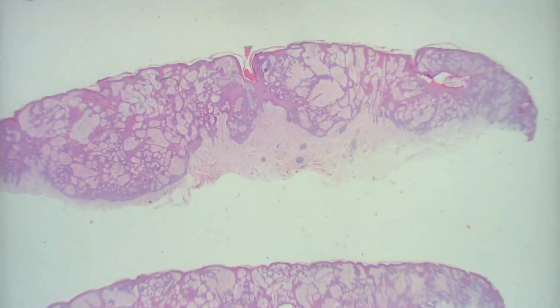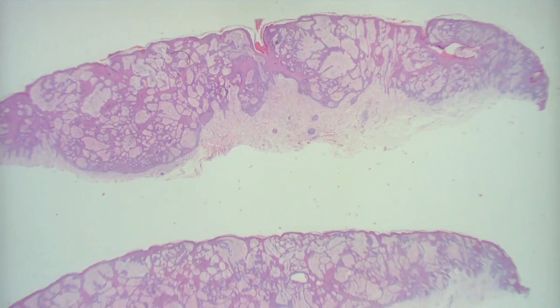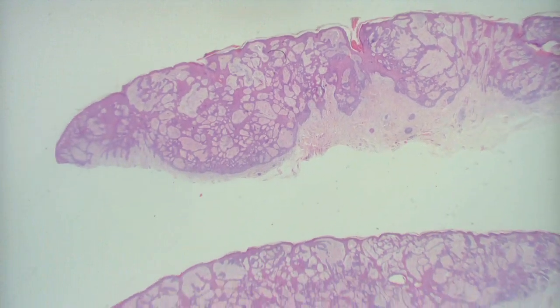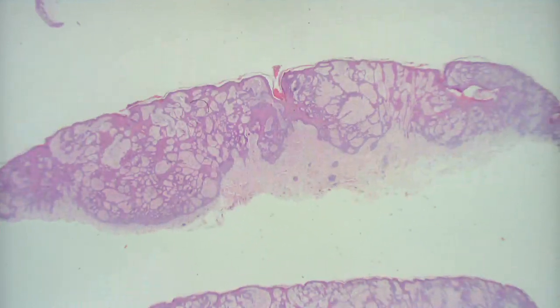All right, so we have a shave biopsy here. We have this trabecular pattern of, I guess I'll call it an infiltrate coming off the epidermis. Yeah, it's reticulated. You're exactly right. And is this inflammatory or neoplastic? Neoplastic. Neoplastic, which is good. What kind of differentiation? I believe follicular.